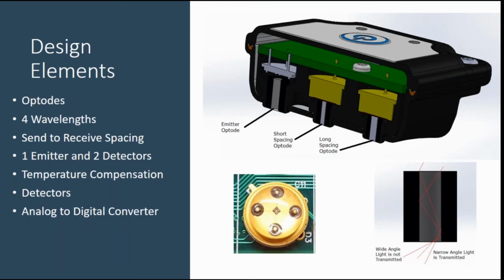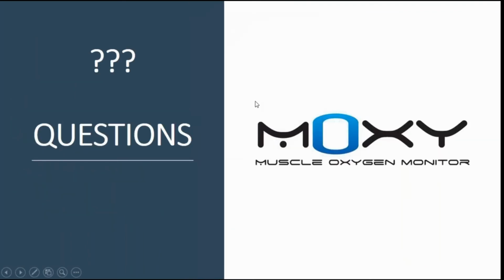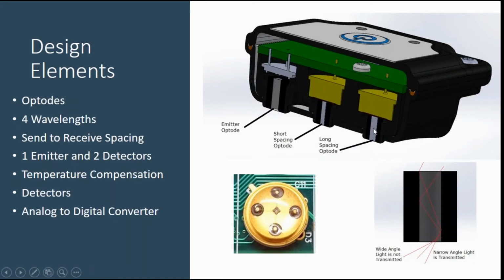So the first design element that's important is the fact that we have these optodes, and really what these are, those gray lines that you're seeing, right here, and right here. These are actually just clear plastic rods, and they're coated with a cladding that makes them fiber optics. So they're able to guide the light either from the LED down to the tissue, or from the tissue back up to the detector.